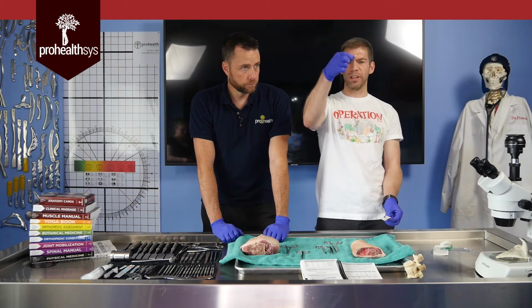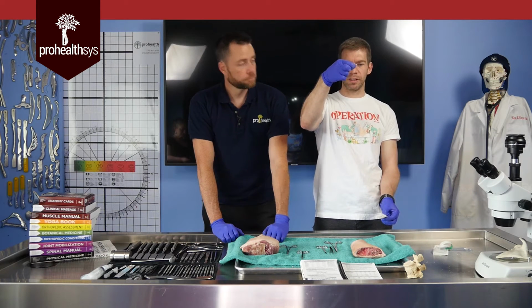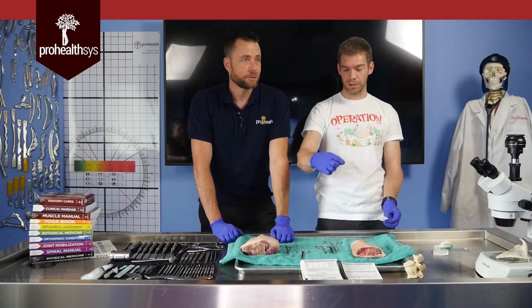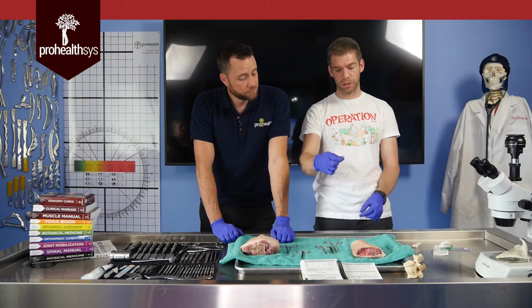You've got this springy looking situation. That's going to be really hard. It's like tying knots with a slinky, and that's hard. Let's put it down here, where you can actually see it. Yeah, it's all springy. So what you're going to do is stretch this material out.